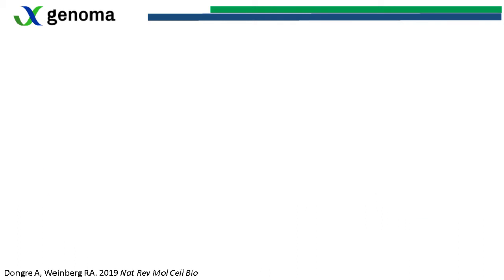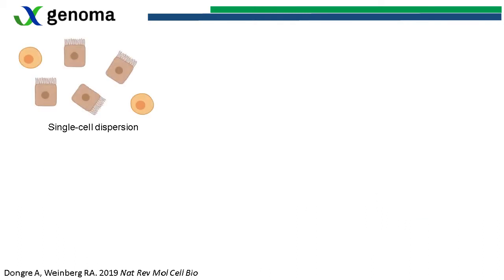So let's talk about 3D bioprinting. 3D bioprinting usually uses a single cell dispersion within a hydrogel. It is a process where there is a several-layer deposition of a biomaterial, and this biomaterial is basically a hydrogel, a gel that could be composed of extracellular matrix perhaps, and cells, the cells that we differentiate.